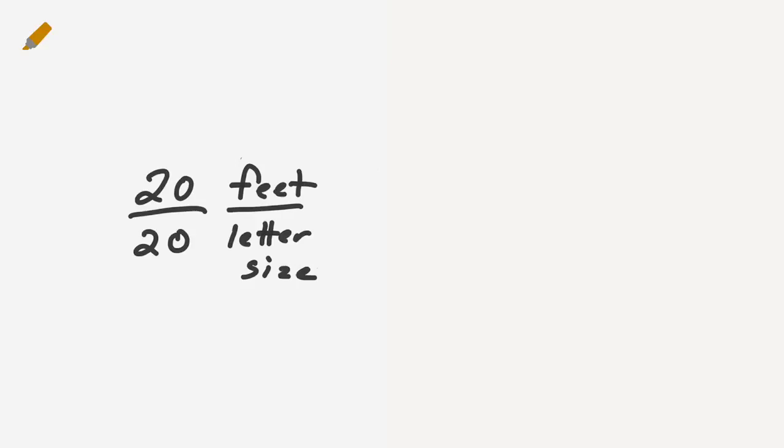All right, let's continue on and talk a little bit more about Snellen and what makes a 20/20 Snellen letter. For that, let's take it to the whiteboard. When you think of 20/20, what comes to mind? Whenever you write 20/20 in a chart or put it in your EHR, what are you actually indicating? What I want you to think of moving forward is a distance over a letter size. So what does the top 20 tell us? It tells us that we're measuring the patient at 20 feet, and they can see a 20 letter size.